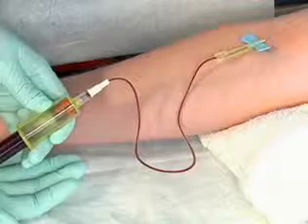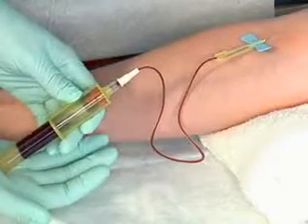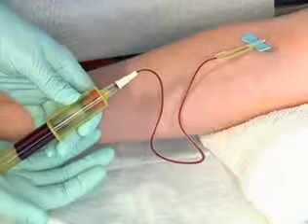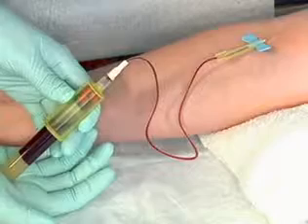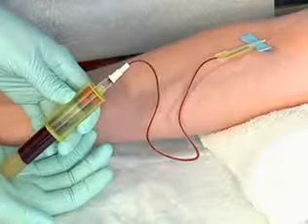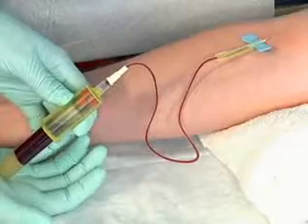Do not remove the tube before the vacuum is exhausted. If you do, a rush of air could enter the tube and damage the red blood cells, leading to inaccurate test results. Also, a tube containing an additive must be filled completely to ensure the correct ratio between the additive and the blood specimen.